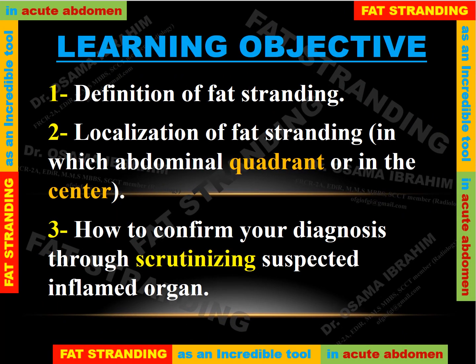The learning objectives from this presentation: first, definition of fat stranding. Second, localization of fat stranding in which abdominal quadrant or in the center. Third, how to confirm your diagnosis through scrutinizing the suspected inflamed organ.